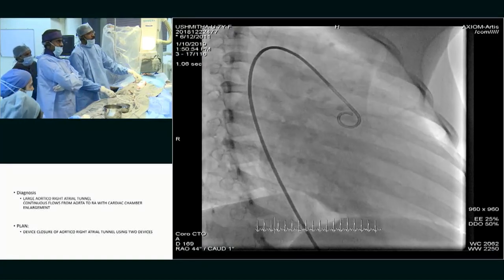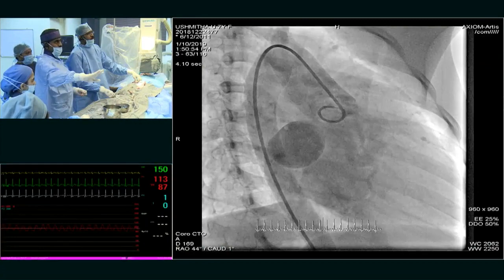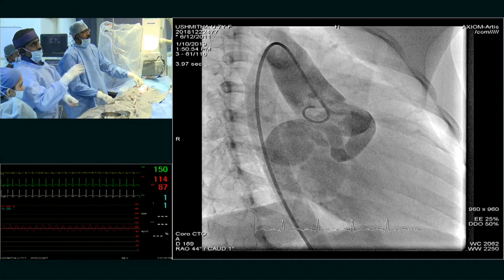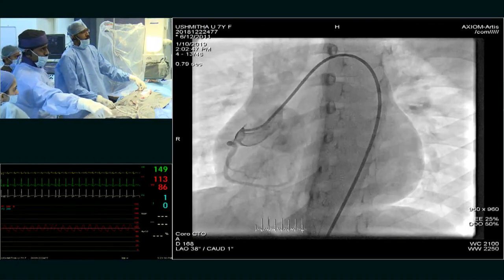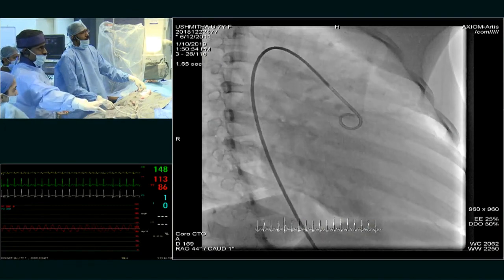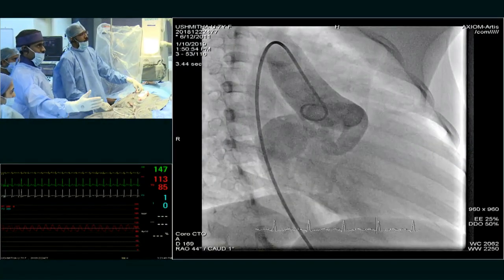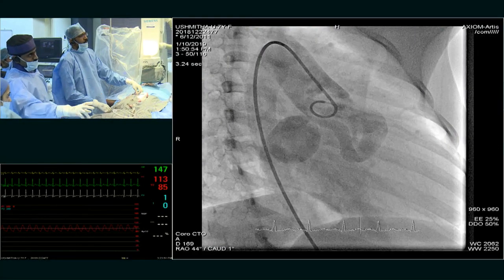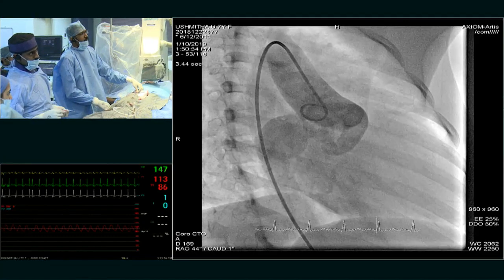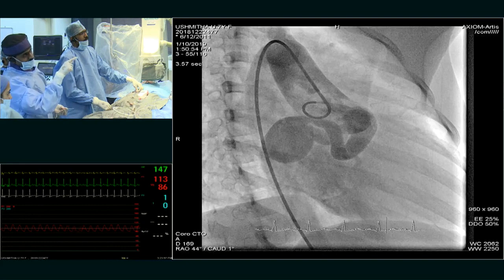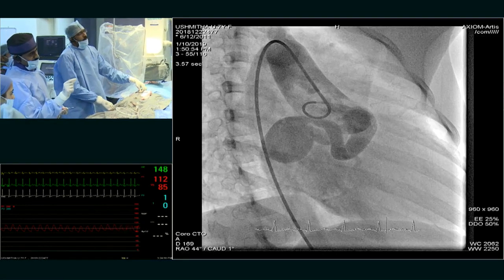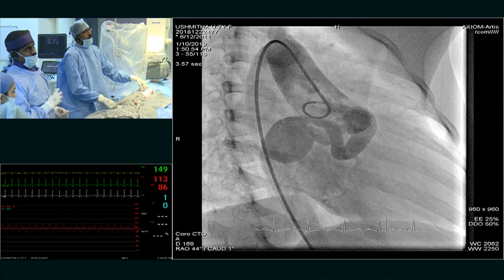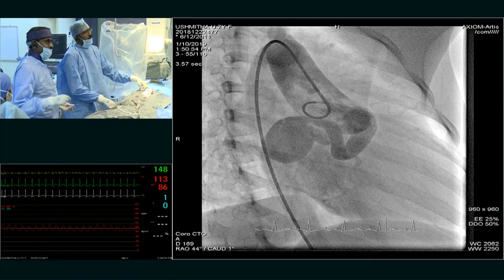This is an RAO projection. The tunnel had a descending arm. So the RCA was arising proximally, and then there is an ascending limb, then a subtle narrowing, and then it enters into an aneurysmal sac with a double pouch, and then the pouch entered into the right atrium.